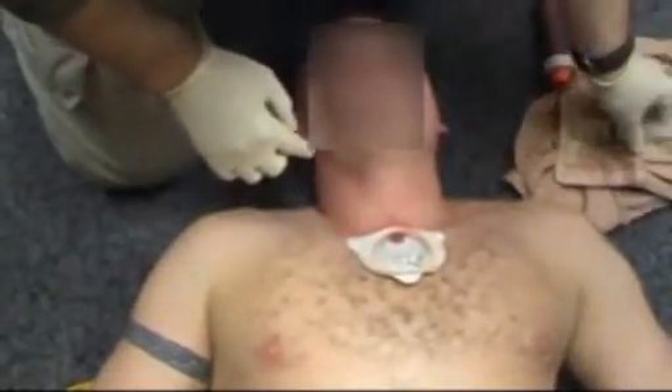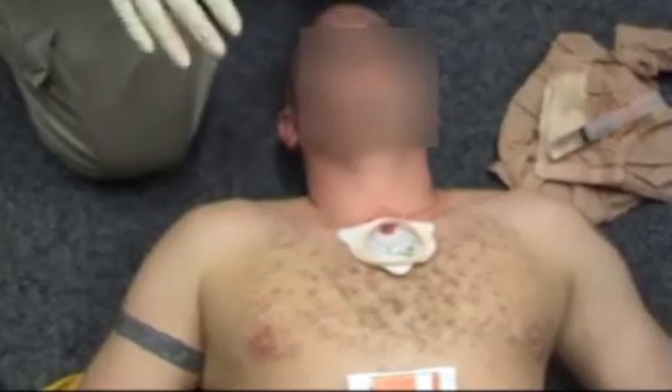So you attach a three-way tap on there. Make sure that's away — the most important thing is attach that to the patient. Put fluid in as much as you want; you can put anything through there.